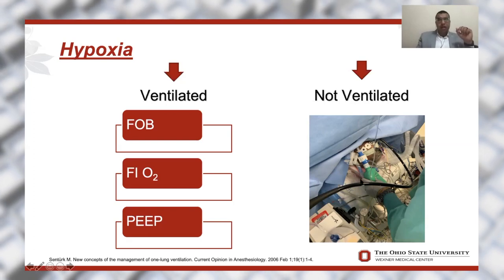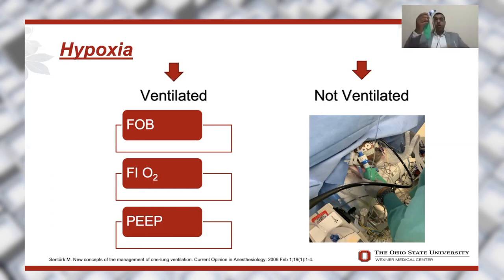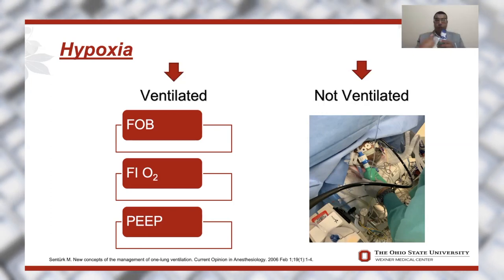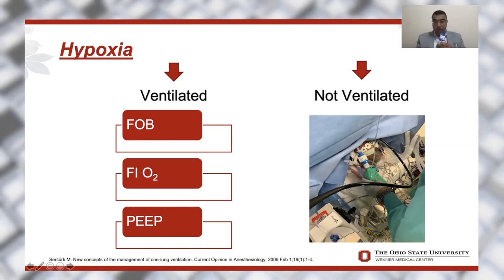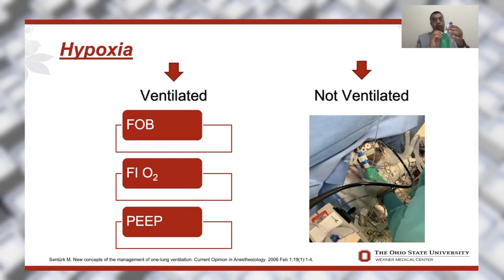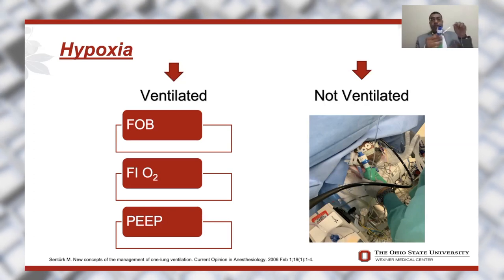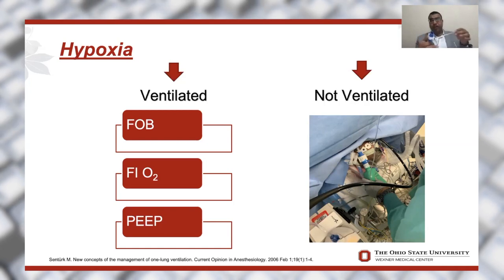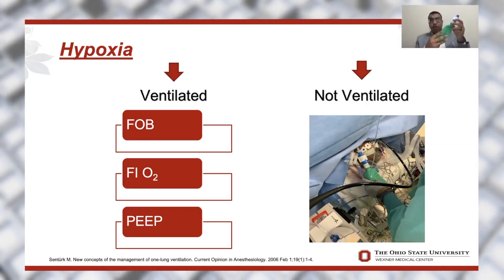For the non-ventilated lung, I think it's technically difficult, but we can use this bag, I hope it's clear. We connected it, as we can see in this photo. This is the ventilated lung. This is the non-ventilated lung. I will put it here. It's a pressure from 1 to 10, not more. You can do something like pressure support ventilation for the non-ventilated lung, but it's for sure taking a different approach in single lung transplant. And you can make some recruitment for this non-ventilated lung.